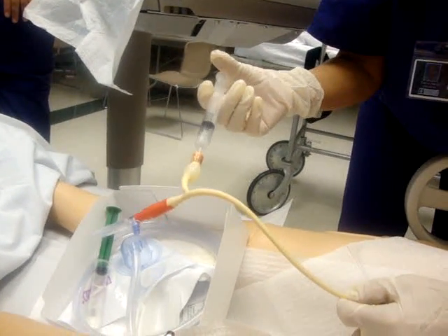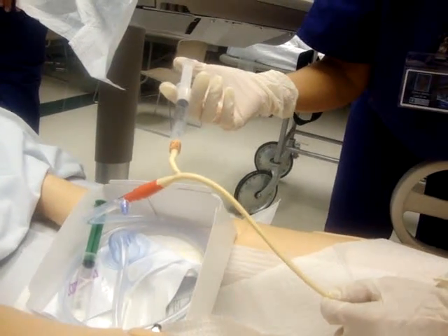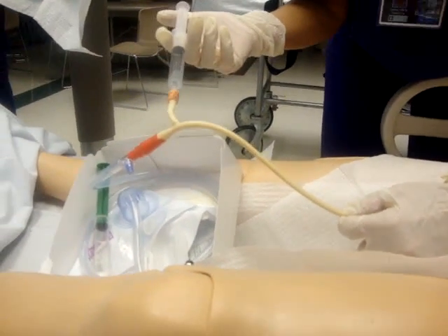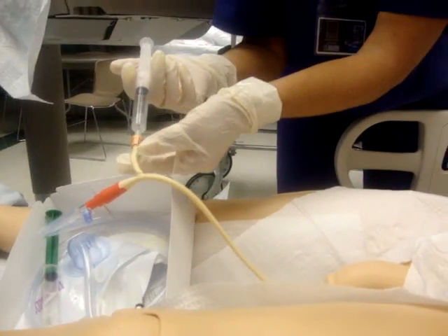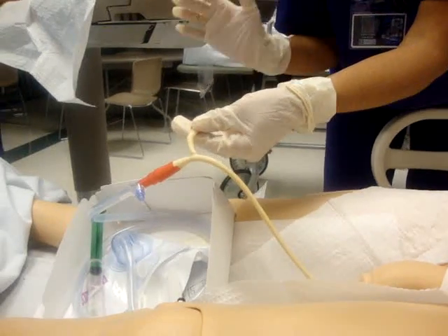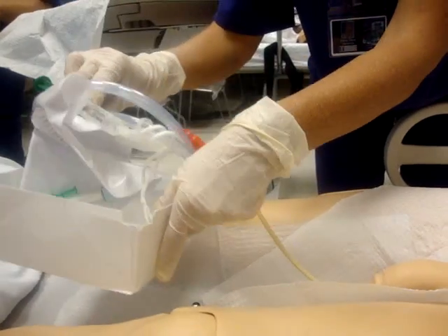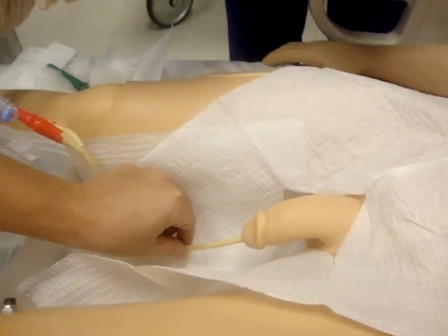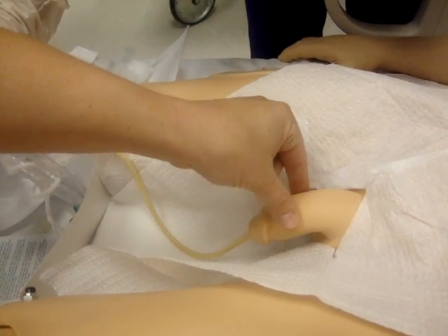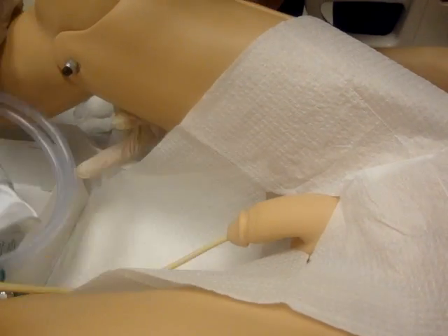Slow down — it's okay, it's not going to go in. Now it's going to stay; it's not going to come out because your balloon is inflated. Now that it's in place you can let go. Take this off and drop — it's fine. It's in. Once that balloon is inflated, pull it back slightly to make sure it's sitting against the wall of the bladder — just a little tug. Any foreskin or skin you pulled back, you pull down. Then bring this under the leg under the drain.